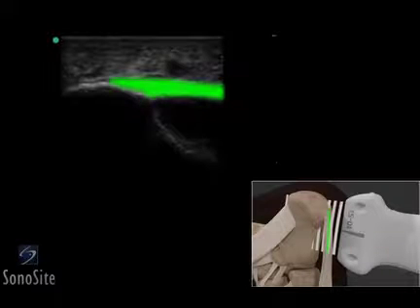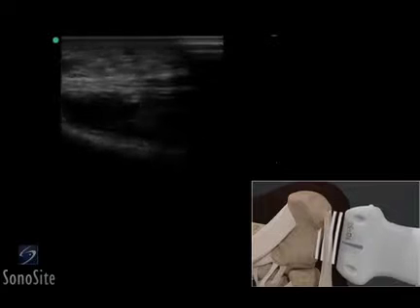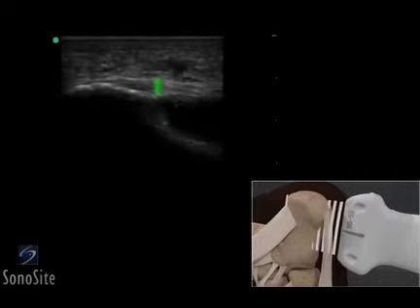The plantar fascia can be seen as a hyperechoic, linear, fibrillar structure that begins at the calcaneal cortex and extends through the base of the foot. The thickness of the plantar fascia should be determined at the proximal end of the fascia at the calcaneal attachment.